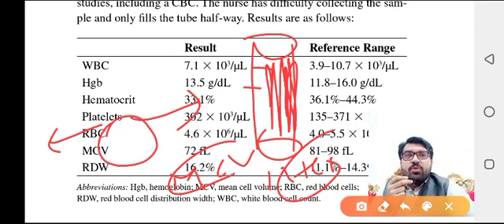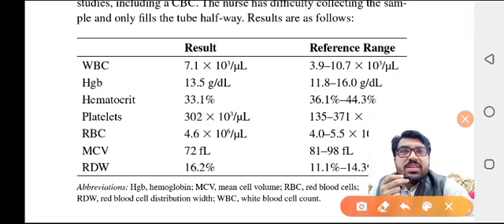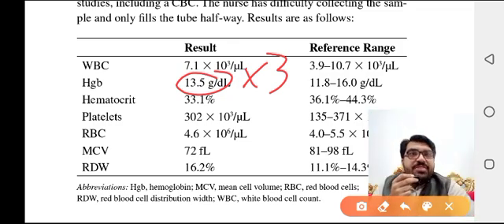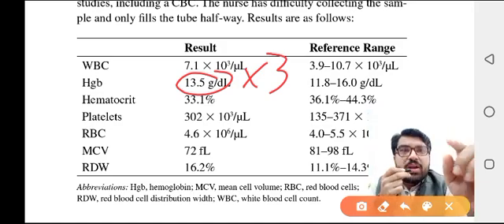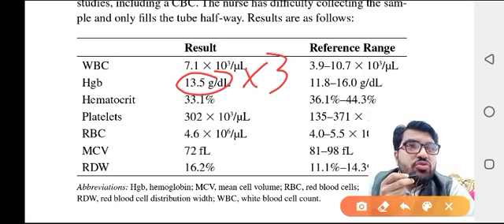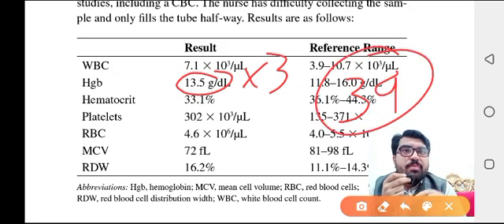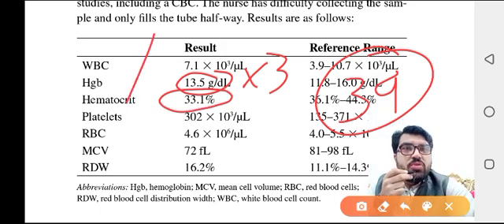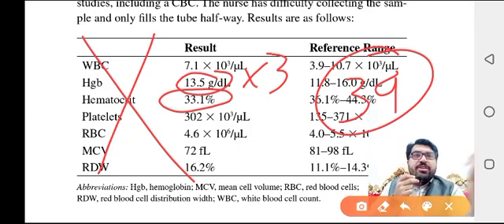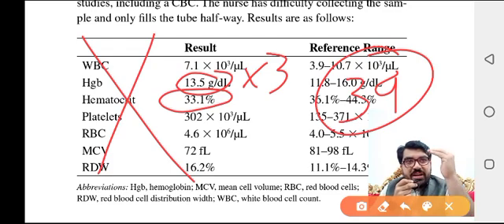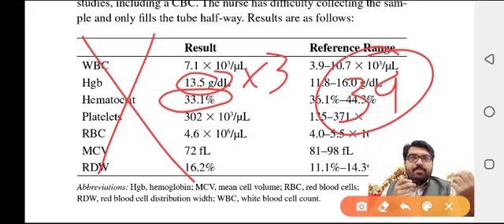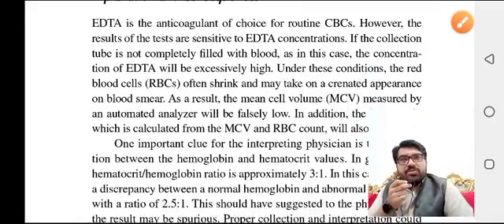How do you check the validity of a CBC — whether the blood was taken up to the mark or not? There is a simple trick: multiply the hemoglobin by three. If that equals the hematocrit, it proves the blood was taken up to the mark. In our example, 13.5 × 3 = 39, but the hematocrit recorded was 33 percent. Since they don't match, the ratio is not 1:3, confirming you must repeat the CBC before ordering any further studies.